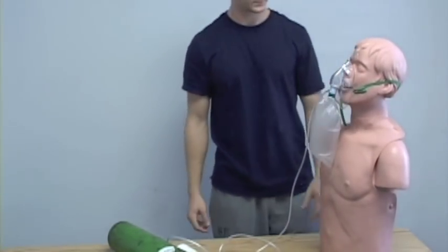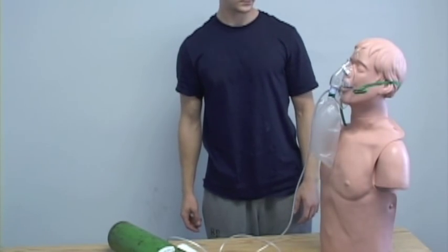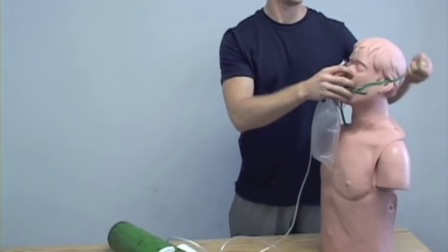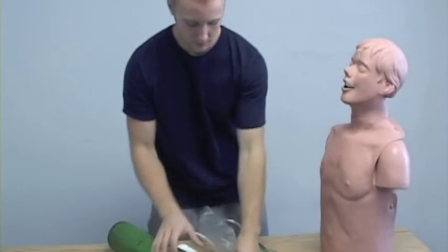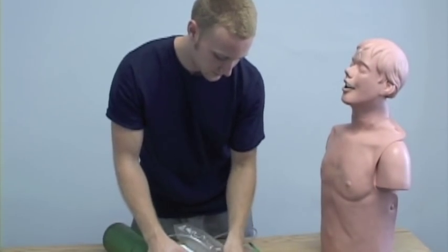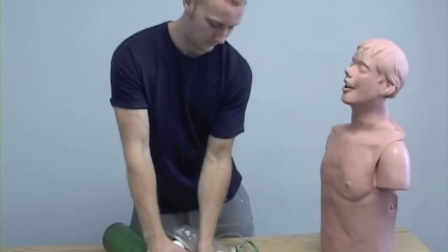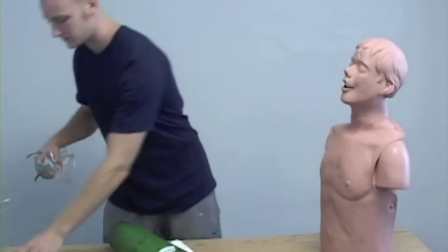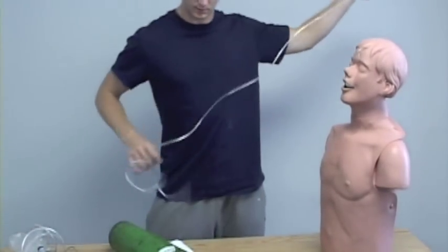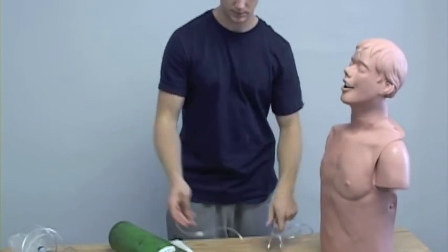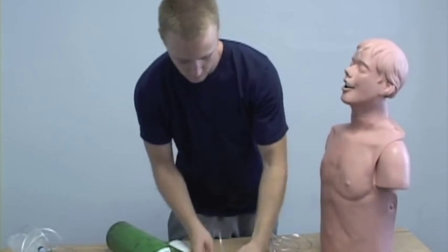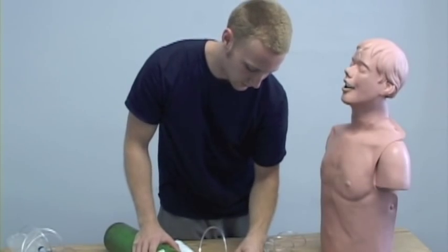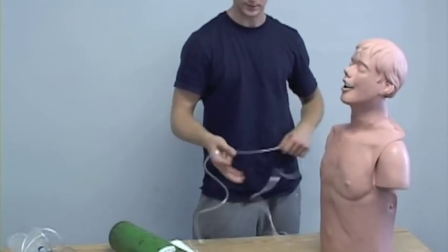The patient is not tolerating the non-rebreather mask. Apply nasal cannula to the patient. Remove it. Turn on the air. Remove the non-rebreather mask. Attach the nasal cannula. Set to 4, anywhere under 6 liters per minute.